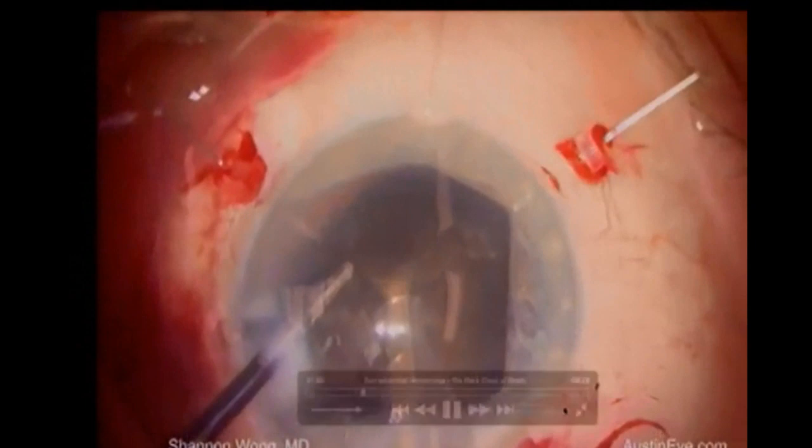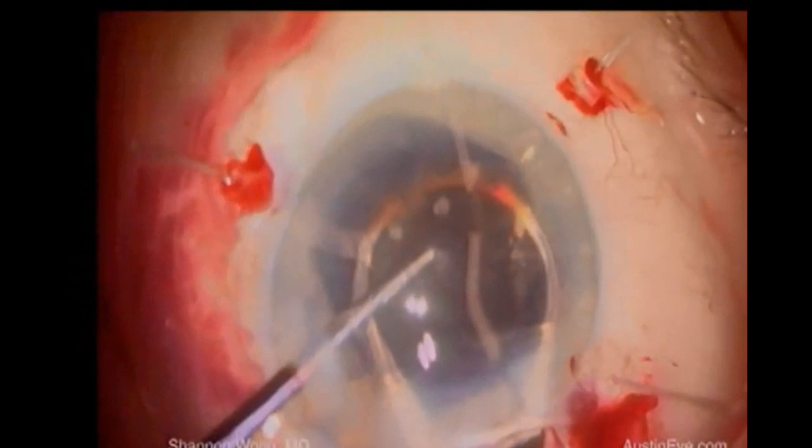So he goes out, and instead of risking continuing phaco, he made the decision to convert to an extracapsular extraction, so the wound was enlarged in an attempt to deliver the nucleus. Now the nucleus has been delivered with a vectis or a lens loop. One quadrant was removed, and now the surgeon is removing the other quadrant.